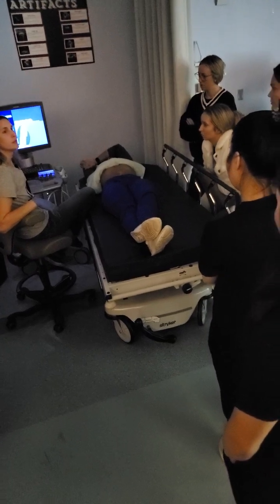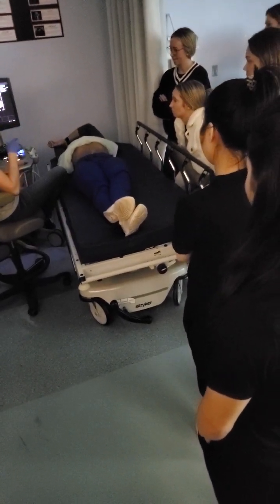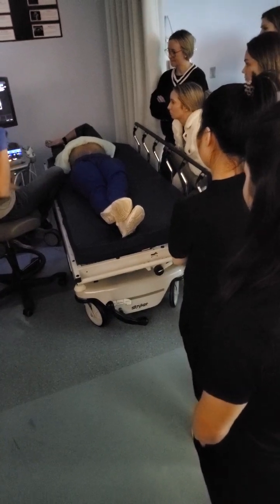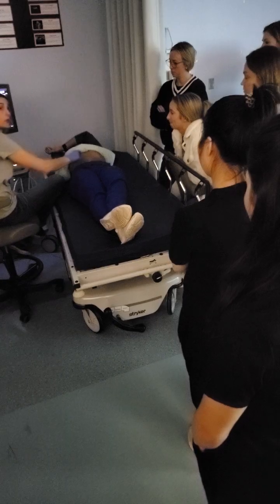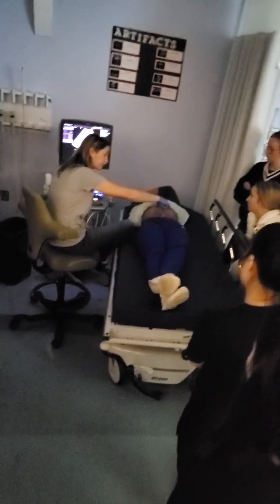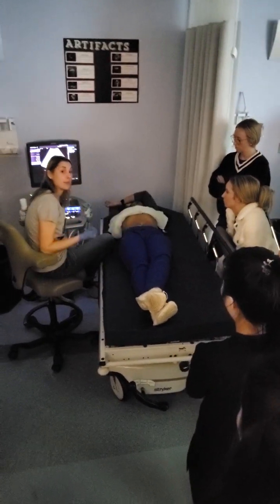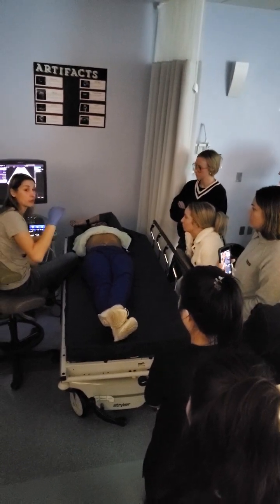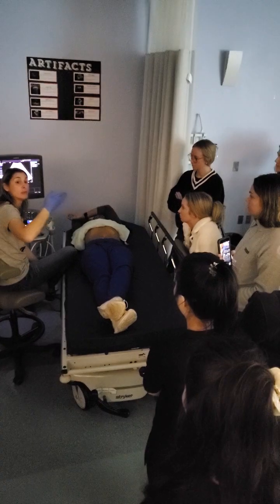Main portal vein. That's going to be a little bit harder just because it's harder to see, but we can try to find that portal splenic confluence. And what does the portal splenic confluence eventually become? So you can trace that main portal vein back if you need to, to try to find that pancreatic head. And then we can do our 7 o'clock. We can also look for the SMA and the aorta. Remember how the SMA, aorta, and left renal vein are going through? If I can see the SMA and aorta, I know I'm in the right neighborhood to be seeing that pancreas as well.